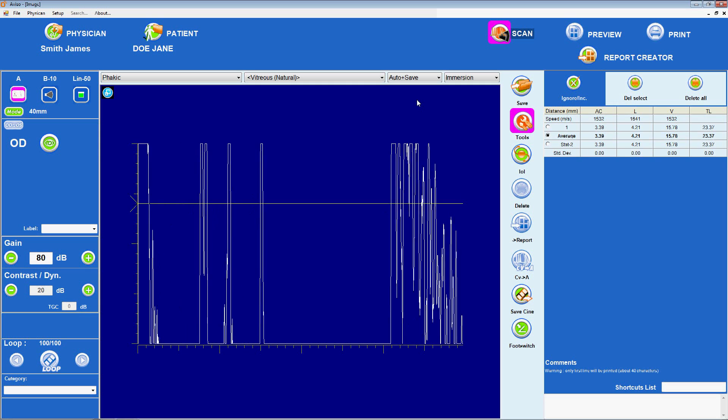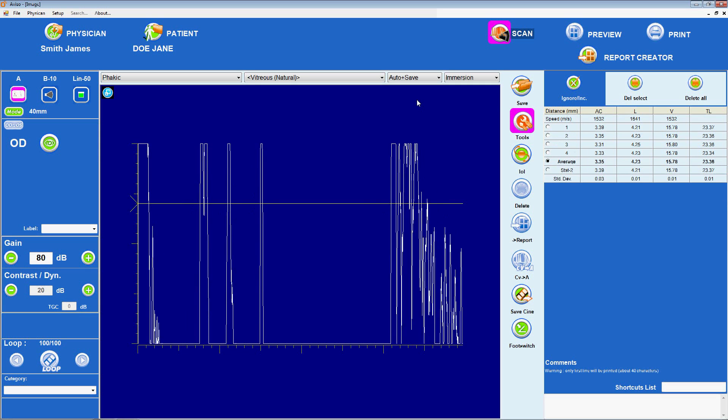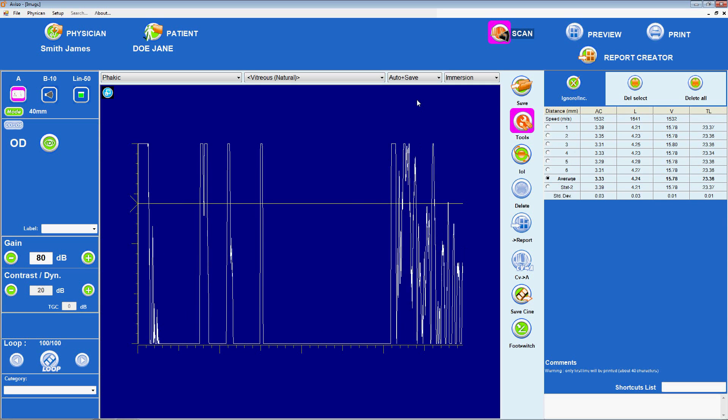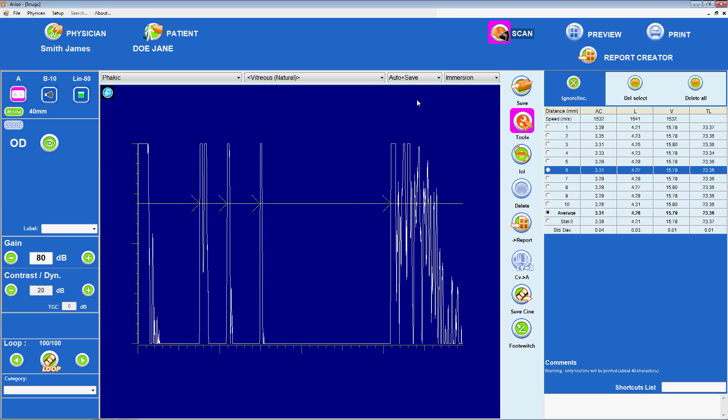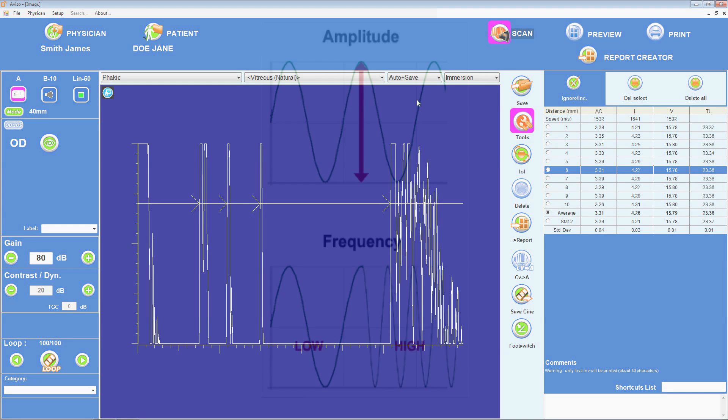The A in A-scan stands for amplitude. When looking at an A-scan image, the amplitude of reflected sound is represented by the height of the spikes.